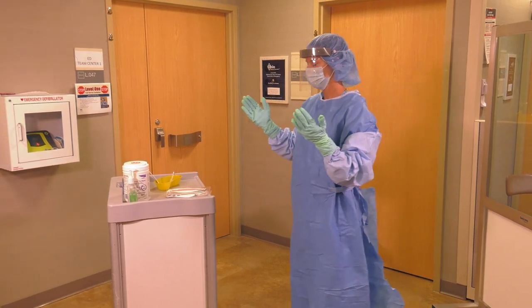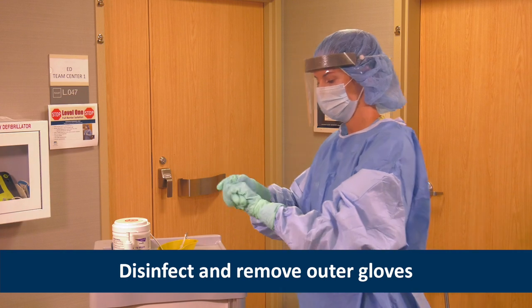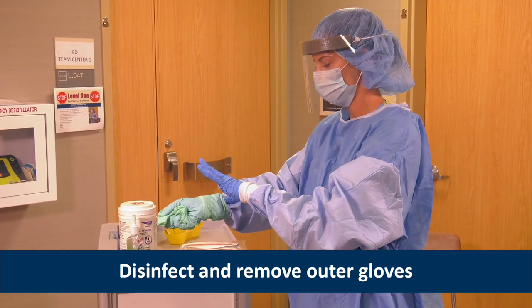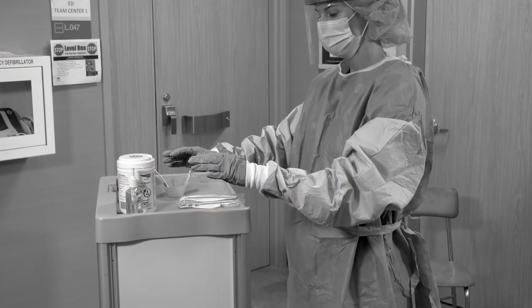Since Heather donned two pairs of extended cuff gloves, she first disinfects the outer gloves with an alcohol-based hand rub and then removes the outer gloves. Because her patient has a suspected viral hemorrhagic fever, the discarded PPE is placed into a red bag inside a leak-proof infectious waste container. If the patient has a suspected respiratory HCID like MERS, SARS, or pandemic influenza, the PPE can be placed into the regular waste stream.